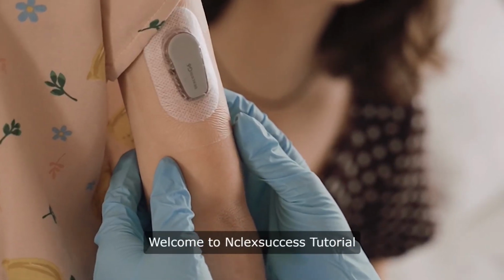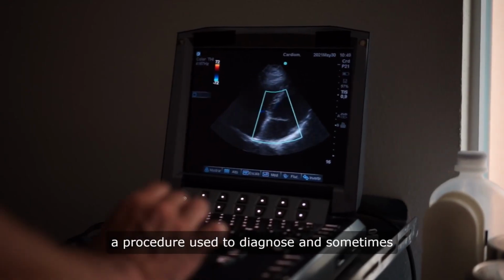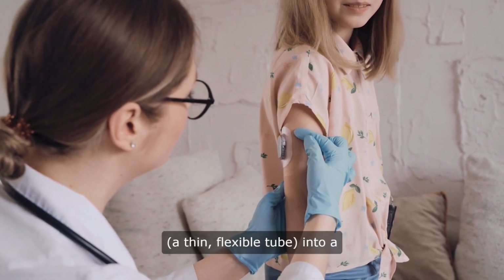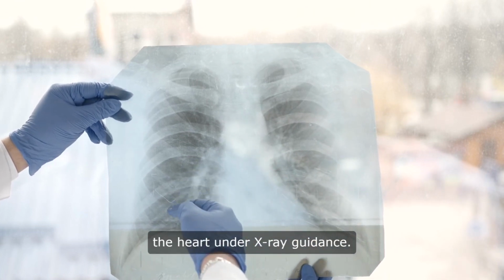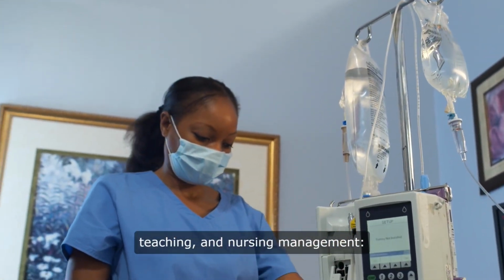Welcome to NCLEX Success Tutorial on Cardiac Catheterization in Pediatrics. Pediatric cardiac catheterization is a procedure used to diagnose and sometimes treat heart conditions in children. It involves inserting a catheter, a thin, flexible tube, into a blood vessel and guiding it to the heart under X-ray guidance. Here's an overview of how the procedure is done, its indications, parent teaching, and nursing management.